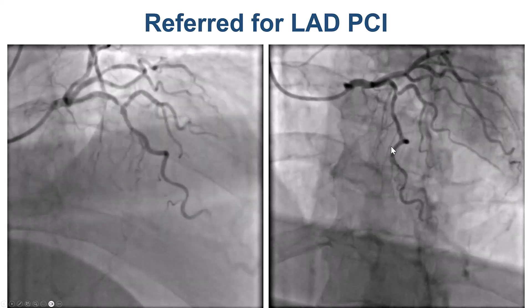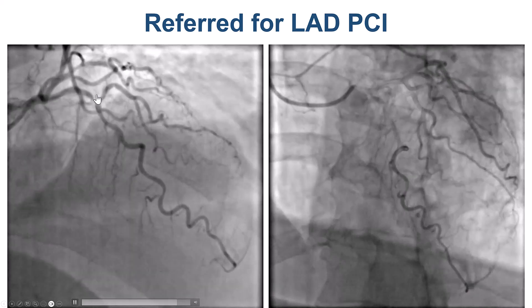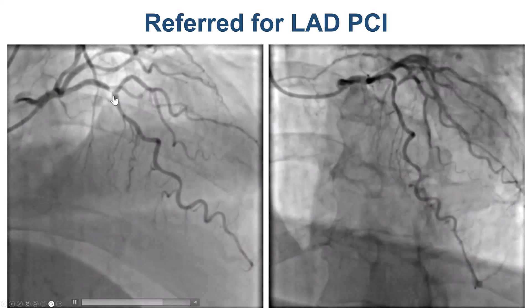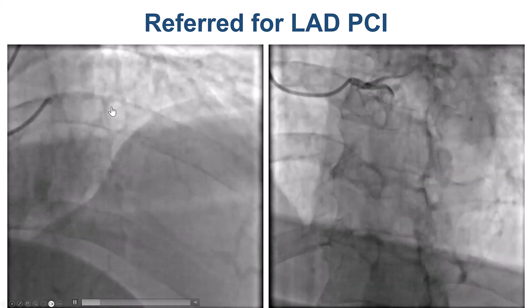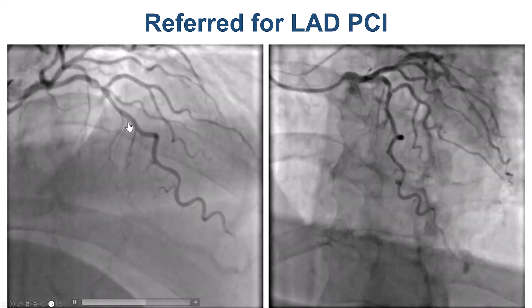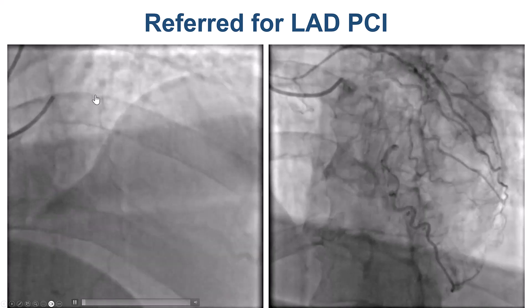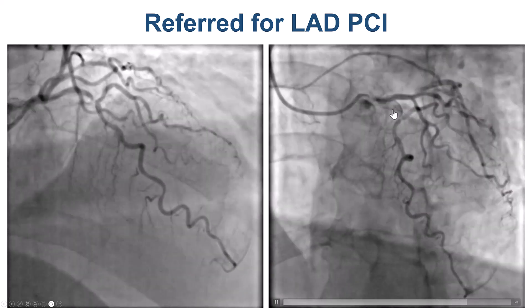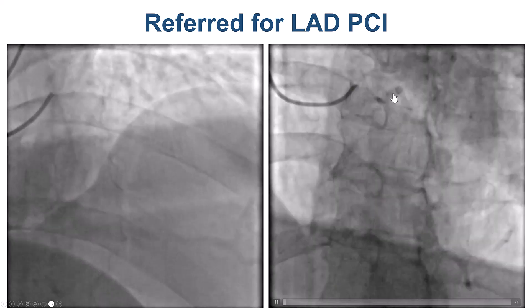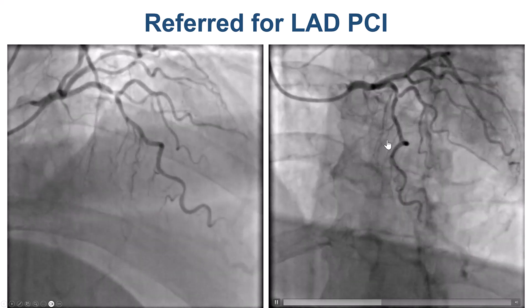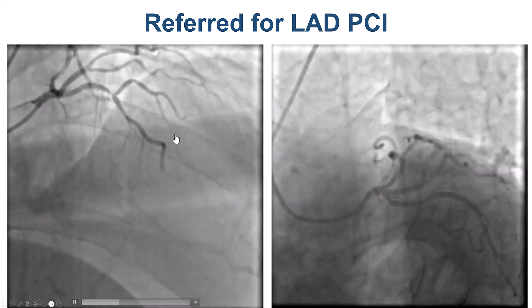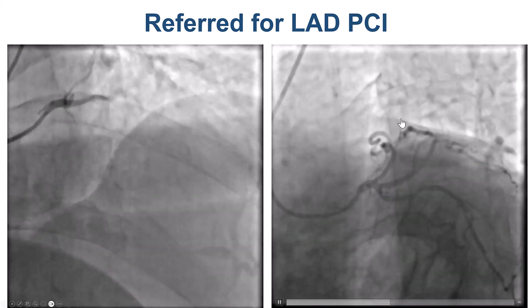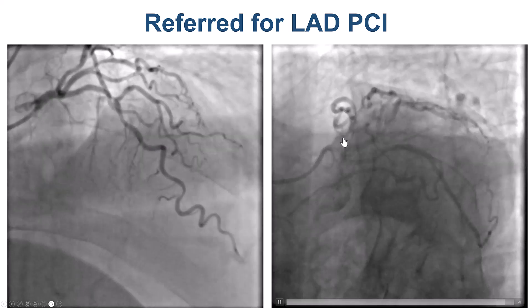This is the coronary angiogram, and as shown on CT we do have disease in the LAD that appears to be significant just proximal to the bifurcation of the large diagonal branch, with some disease also after the takeoff of the diagonal branch. On some views the origin of the diagonal seems to be more significant, which will be important as we'll discuss. On the spider view, the same thing was visualized with the LAD diagonal bifurcation.